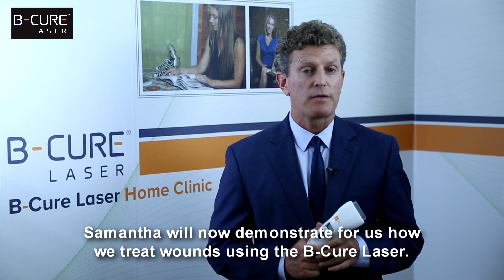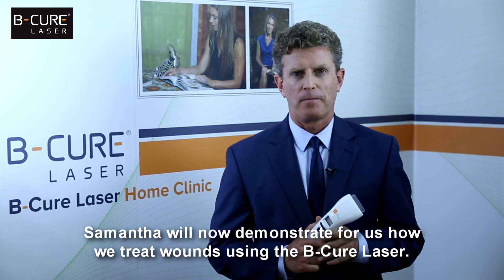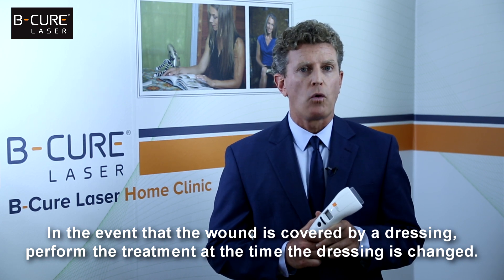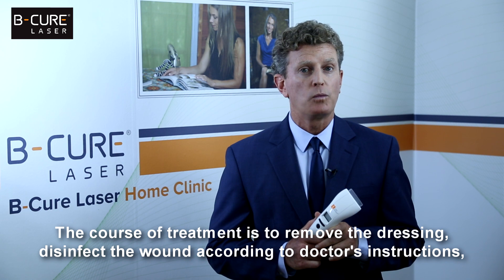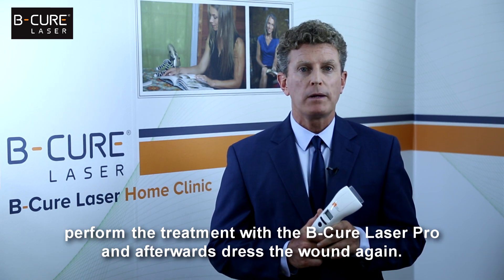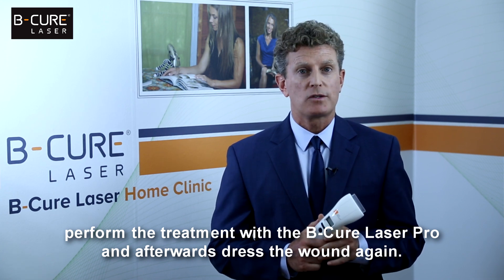Samantha will now demonstrate for us how we treat wounds using the BeCure Laser. In the event that the wound is covered by a dressing, perform the treatment at the time the dressing is changed. The course of treatment is to remove the dressing, disinfect the wound according to doctor's instructions, perform the treatment with the BeCure Laser Pro, and afterwards dress the wound again.